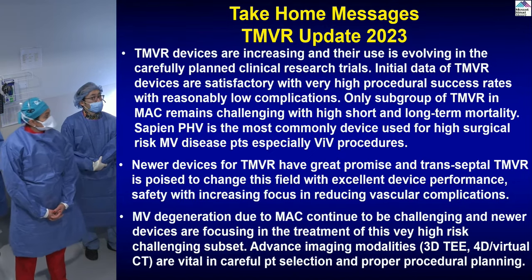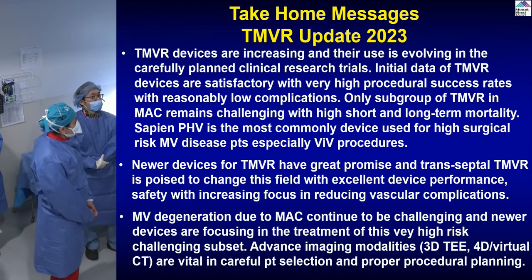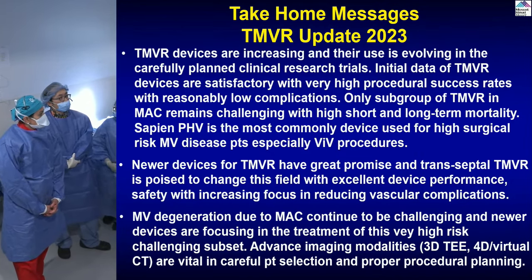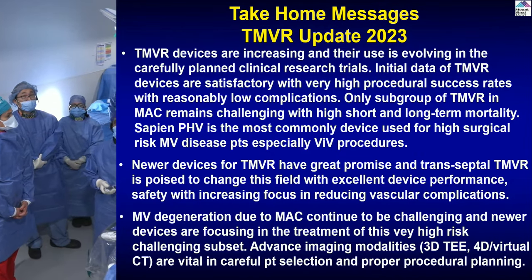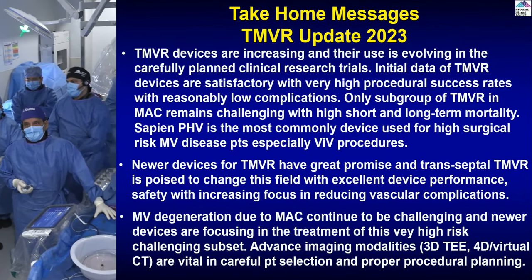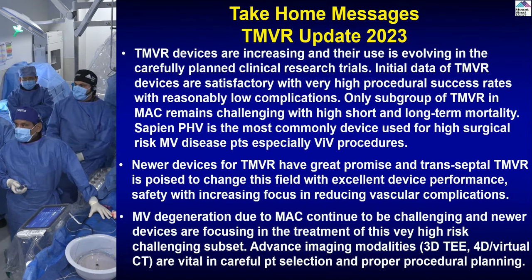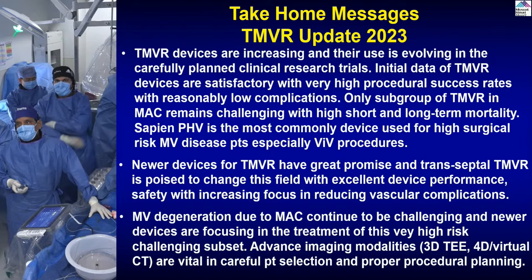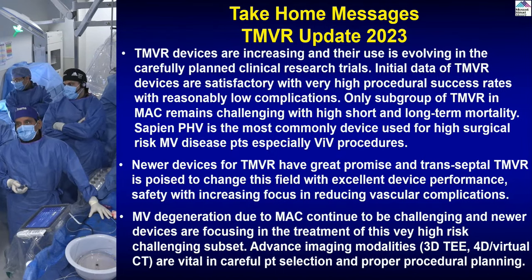Dr. Kini, it's very similar to MitraClip, right? When we started doing MitraClip, it used to be a 2-3 hour case. Now MitraClip is a 15-20 minute case. So it's just a matter of operator experience, right patient selection, and your timings are going to improve, with more cadence and more efficiency. No, the question is which valve design will actually be the one that makes it to the market. That's where I think we are still going through the various phases. Once that is done, then there will be the learning curve for us.